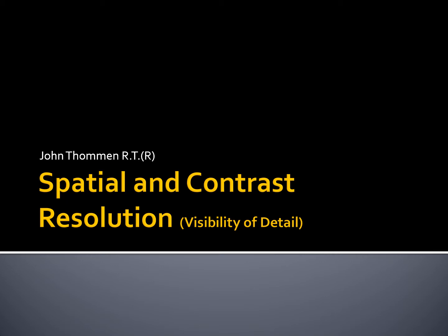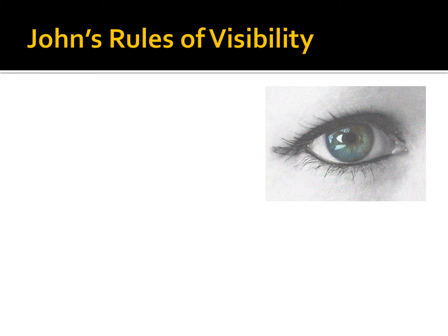In this presentation, we will explore the concepts of spatial and contrast resolution as they relate to digital radiography. Under older paradigms, spatial and contrast resolution might also be known as detail and visibility of detail, respectively. Before we start, there are a few rules to consider. They're not hard to remember and make abundant sense.